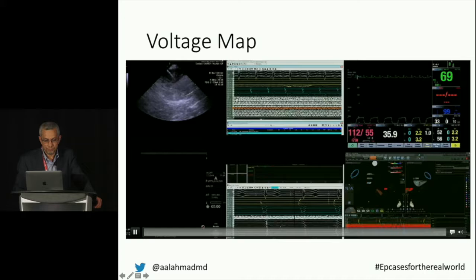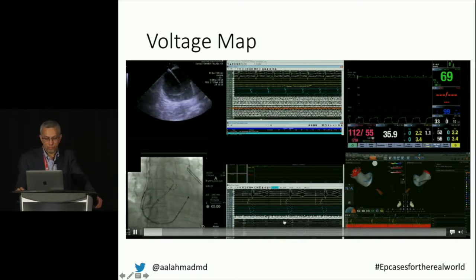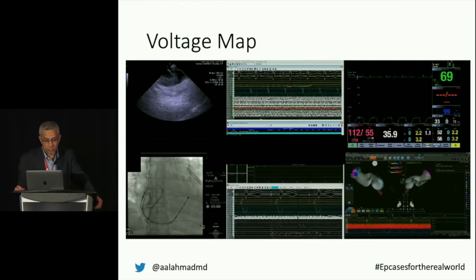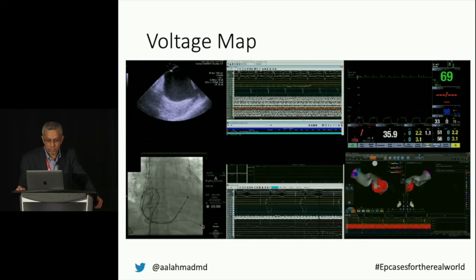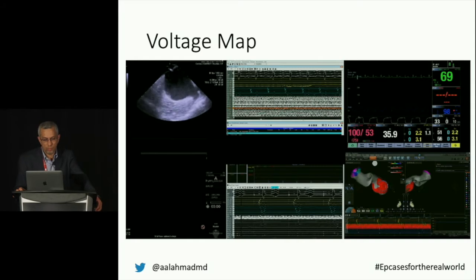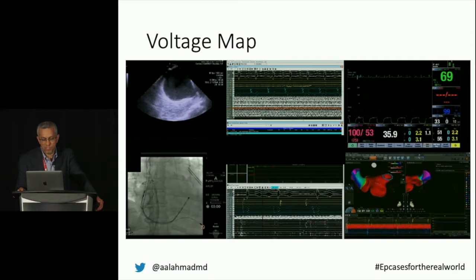So this is sort of the, maybe I overclicked. But you can sort of see right there where the lasso goes to the appendage area that there's a fair amount of voltage there, and a lot of the atrium is essentially at this point, after multiple ablations, you'd hope that the veins are isolated. And indeed, in this case, the veins are isolated. Now that's sort of the conundrum, because now you've got somebody who keeps having AFib, but the veins are isolated. So you're really left essentially with the concept that they have to have some triggers that are not coming from the pulmonary veins.